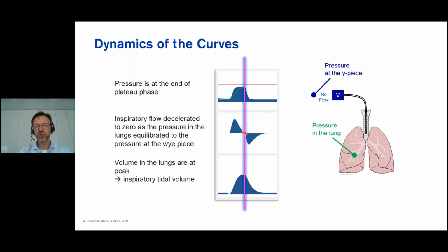It's like in pressure conditions where you have a high pressure zone and a low pressure zone. And if you have this high and low pressure zone, then the consequence is wind. If you have the same pressure in both zones, then you will not see any wind because there's the same pressure.